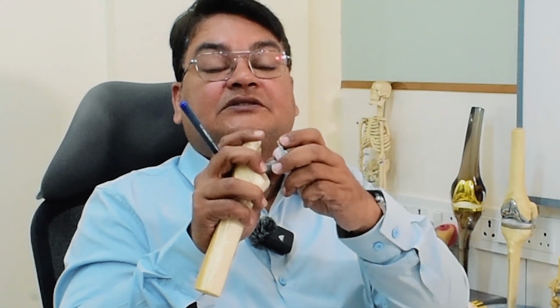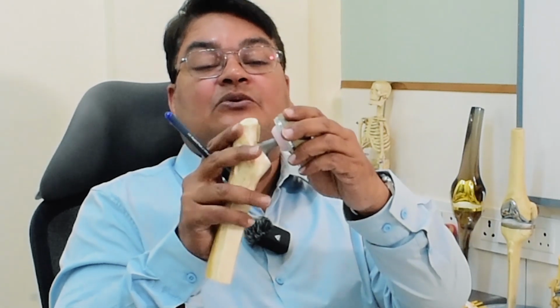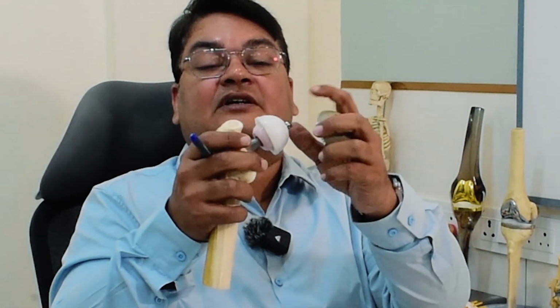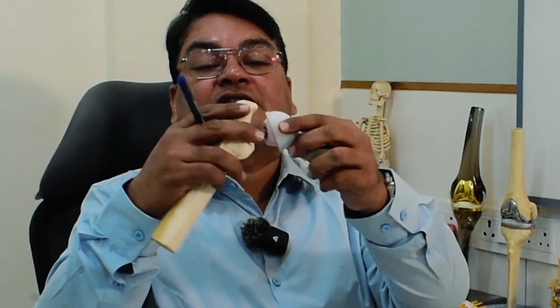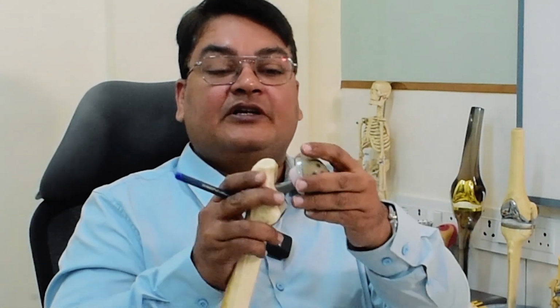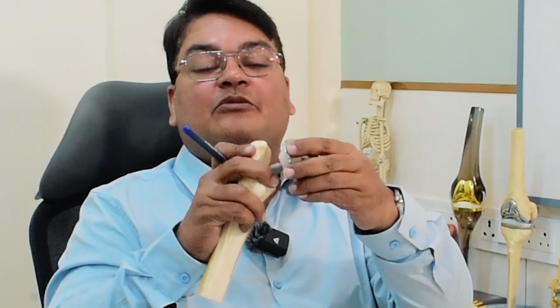And whenever there is a chance of dislocation, then in that case we use dual mobility. So dual mobility means this is standard hip replacement, large head. And in dual mobility, the polyethylene is put on the head and that also moves, like this is moving like this and this is also moving like this. So it is dual mobility.